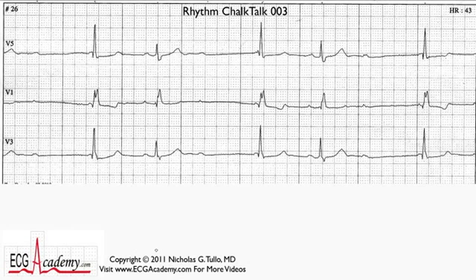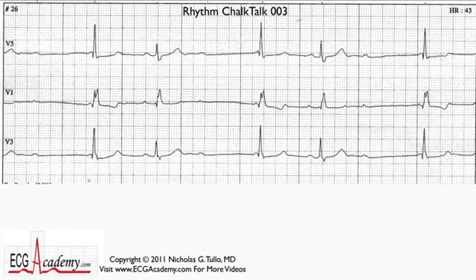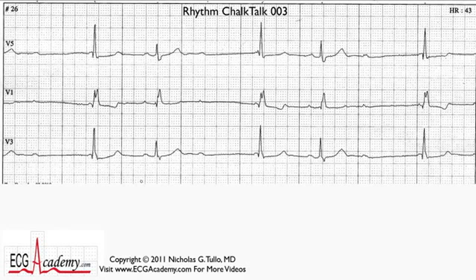This is Rhythm Chalk Talk number 3, and I must say it's very challenging. A lot of cardiologists I know wouldn't get this right, but I'm going to help you work your way through it. One big hint is that this is actually the same patient as Chalk Talk number 2, which was a case of second degree type 2 AV block. Type 1 and type 2 second degree AV block almost never occur in the same patient, at least not at the same time.